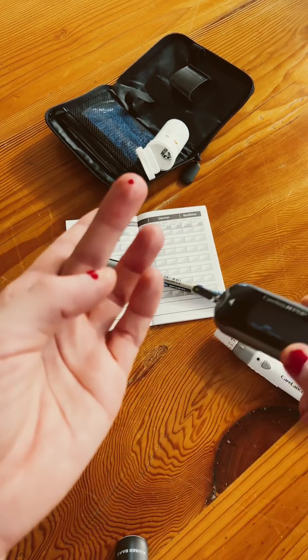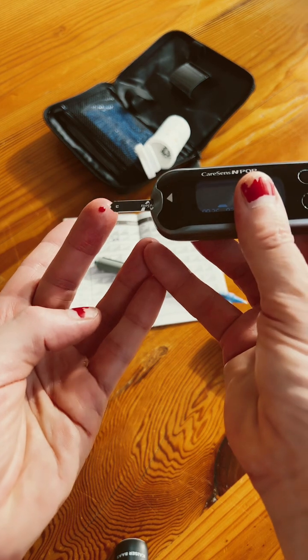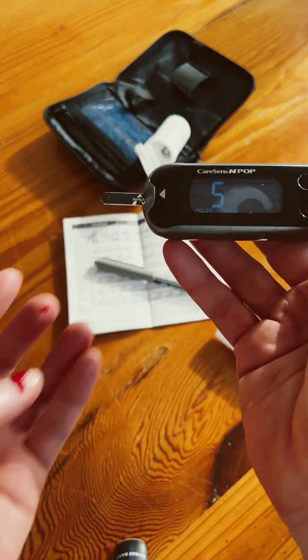Then you squeeze that, and you put the end of the strip just on the edge of the blood here, and it'll suck it up. Then you wait for the reading.